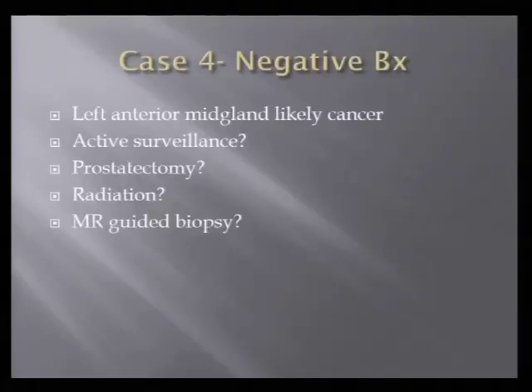But what happened is usually troubleshooting. Sometimes in a case like this, if the PSA was high enough, they'd go to prostatectomy and prove it, and they'd have very, very good results. I know it sounds shocking, but they would. And so this one I don't have the results for, though, so I'm not saying that that's a cancer or not.